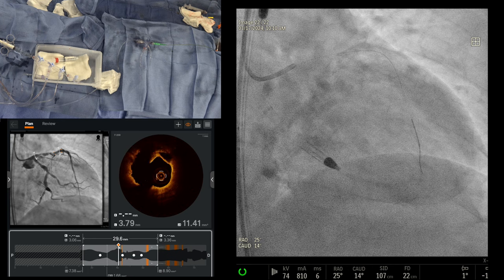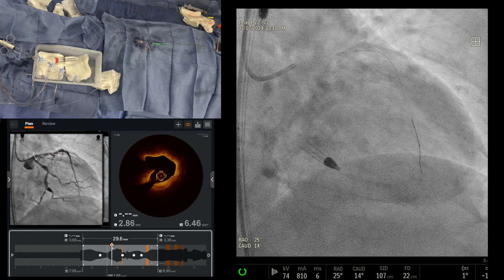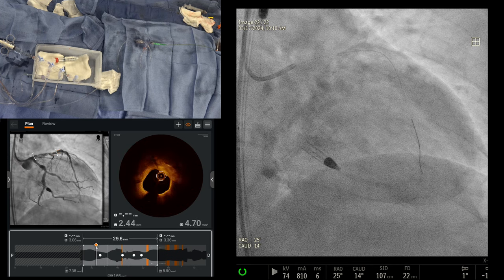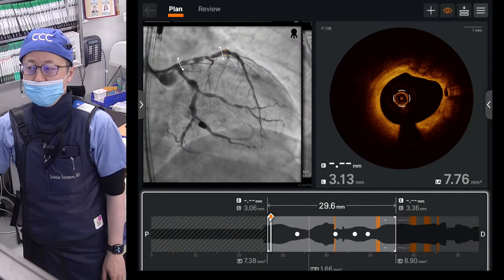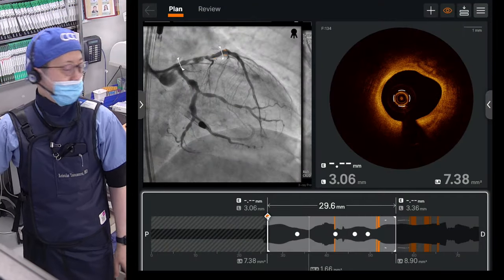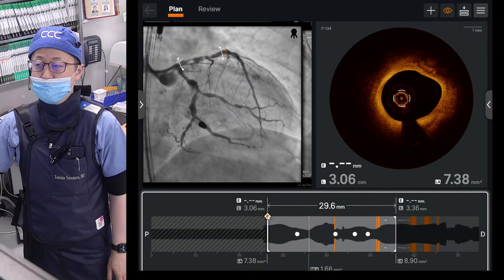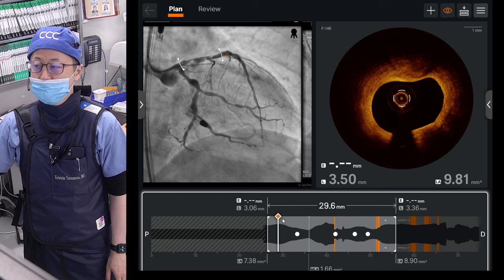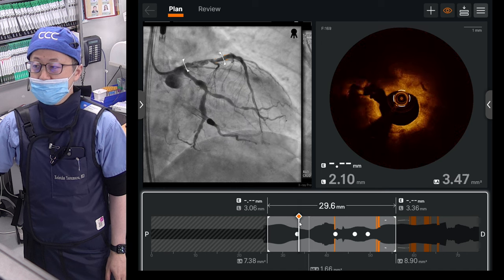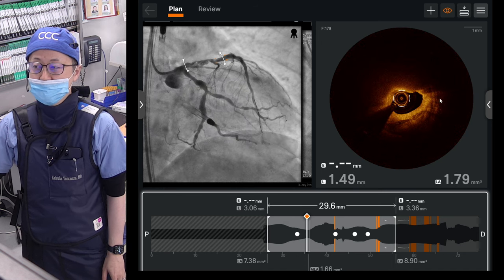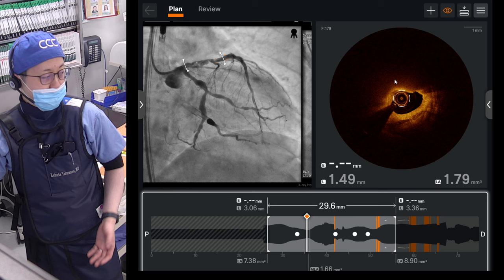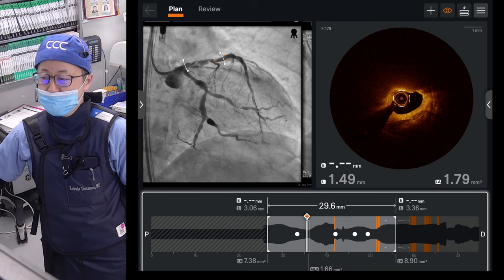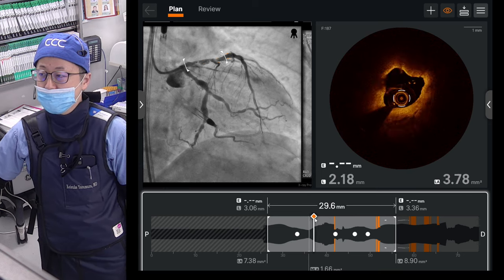40% is a good number. Show us the OCT imaging. I'll show from the start of the proximal part coming to the distal. This is the proximal tightest part — this is low attenuation, but it's not calcium. It's a lipid plaque at the proximal part. Going more distally, I see about a 90-degree calcium after the region, but not severe calcium. Going further distally, now there's a lot of calcium here.